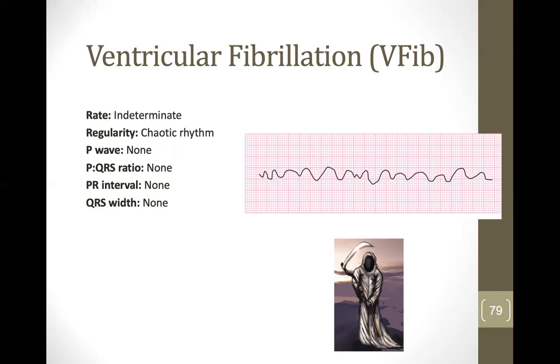External because it's outside of the body, and a defibrillator, right? Fibrillation is to quiver. We are going to stop the quivering. So it delivers a jolt of electricity in hopes that it will stop the chaoticness and start again with a normal rhythm, right? So that's what an AED does, an automated external defibrillator.